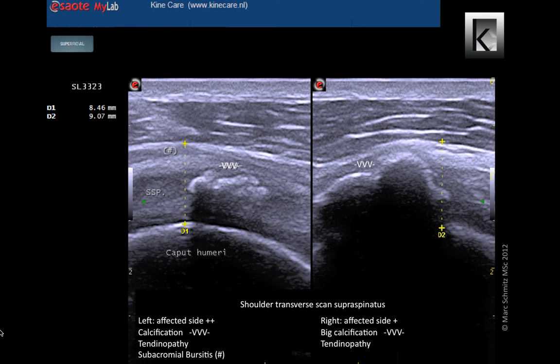This patient had a lot of pain on both sides, left more than right. Big intratendinous calcifications can be seen. Of course these calcifications are not the only cause of the pain, but they certainly interfere with the treatment. How successful would physiotherapy be in such a case?